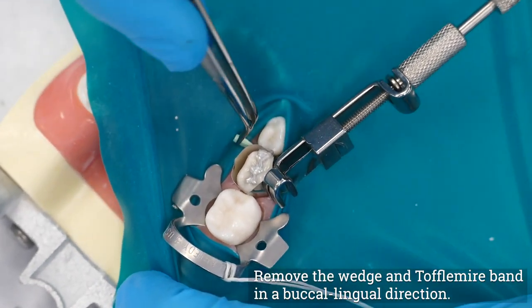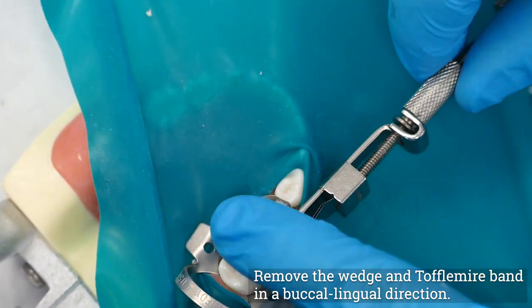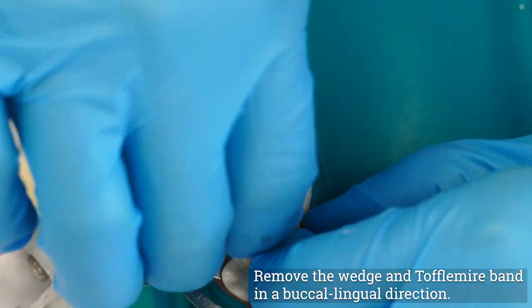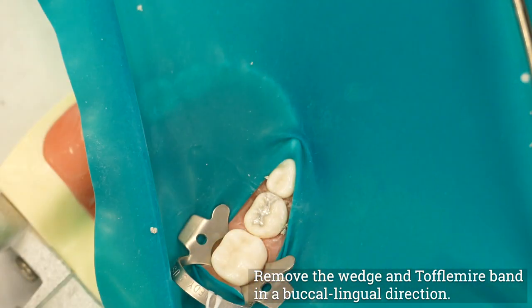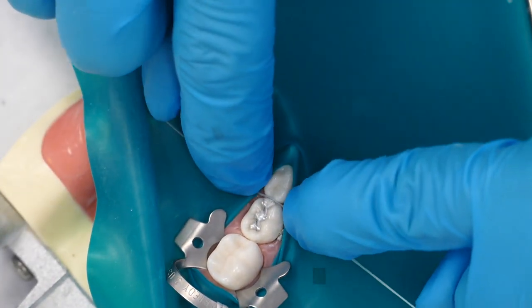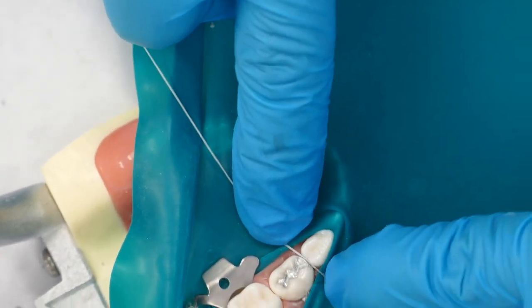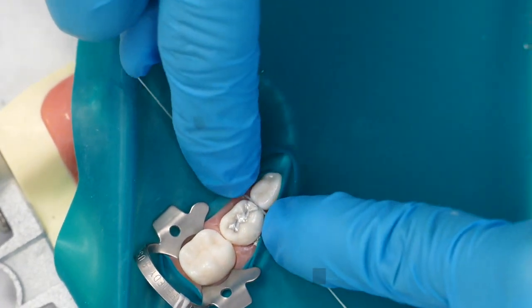Carefully remove the wedge and the band, drawing the band in a buccal-lingual direction as opposed to an occlusal direction, as this will be less likely to damage the marginal ridge of the newly placed restoration during withdrawal. Gently floss the interproximal contact to check the tightness of the contact, to check for a gingival overhang, and to remove any loose amalgam particles from the interproximal region.